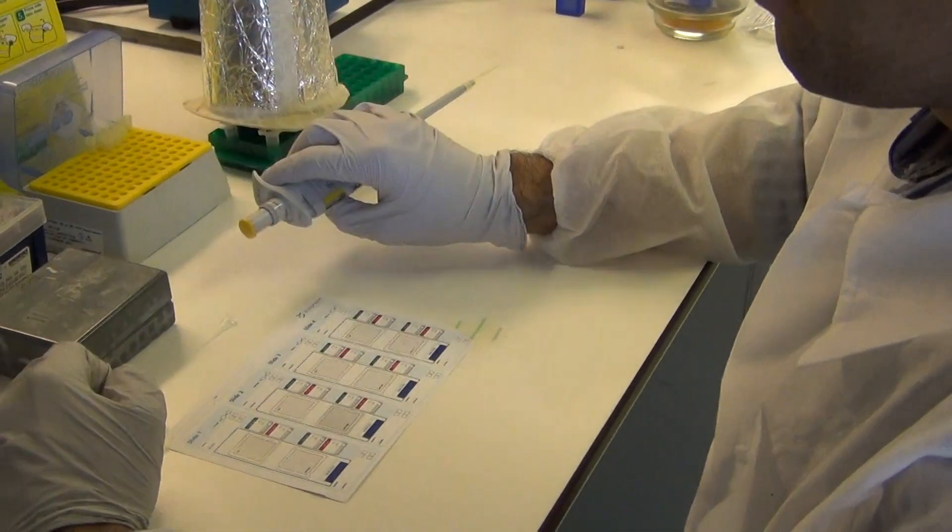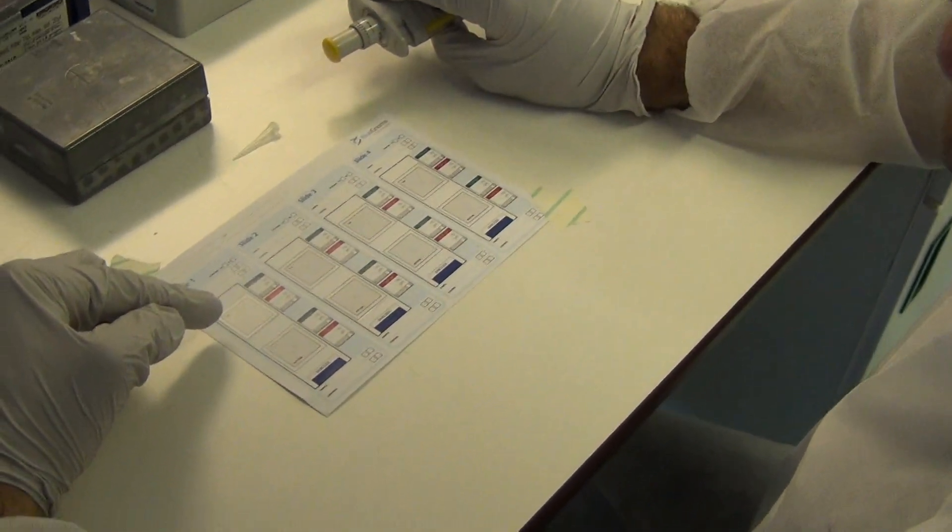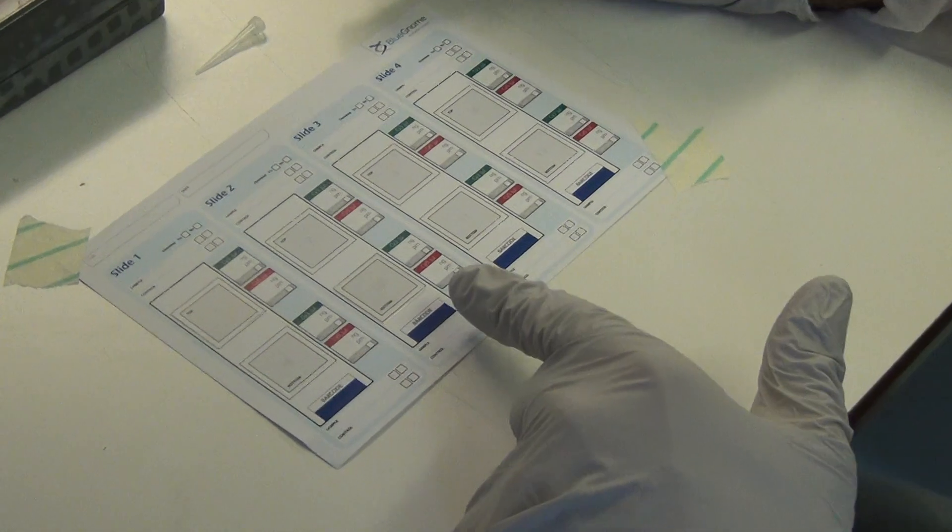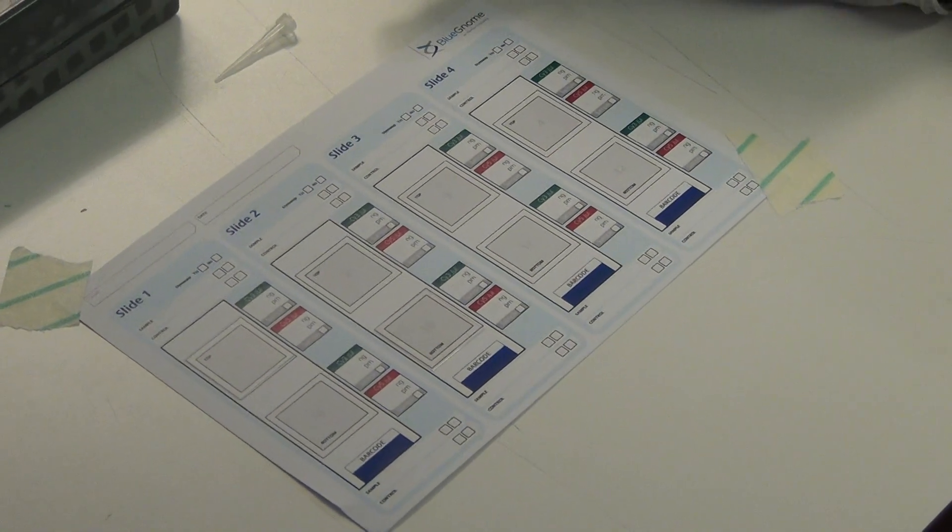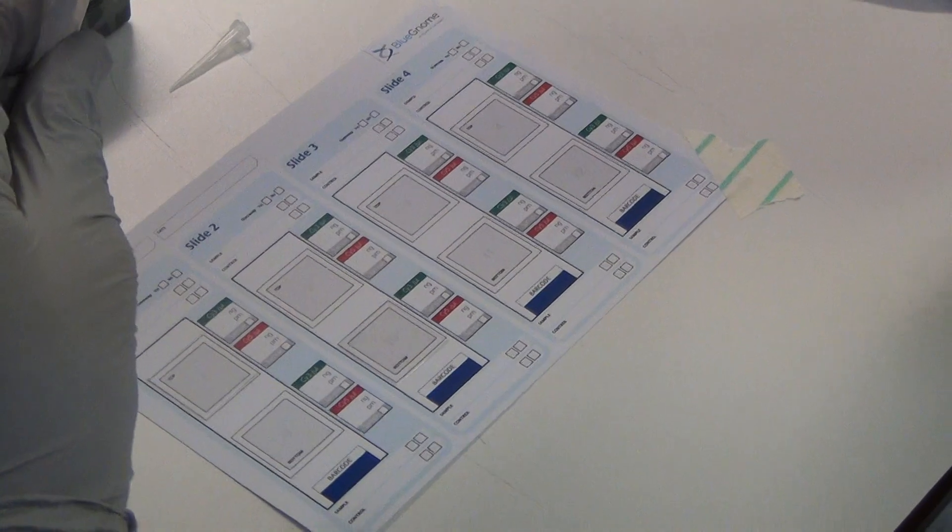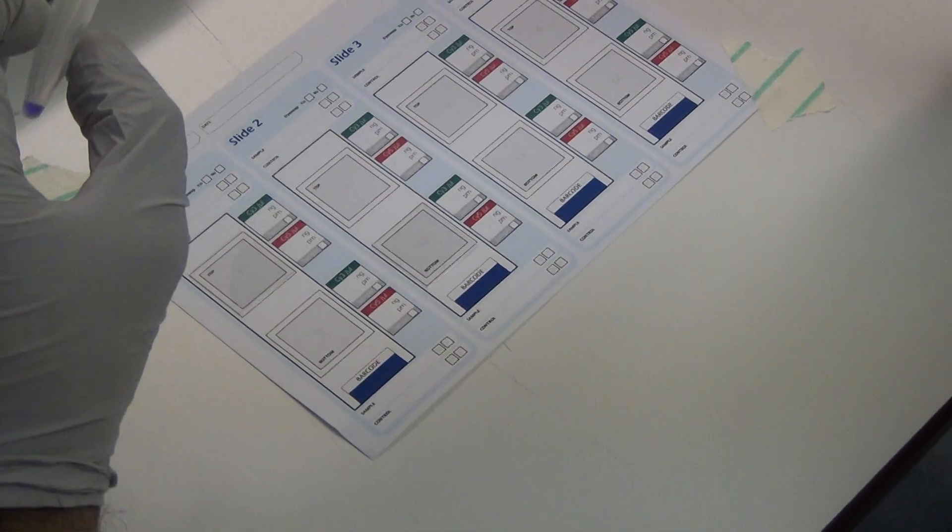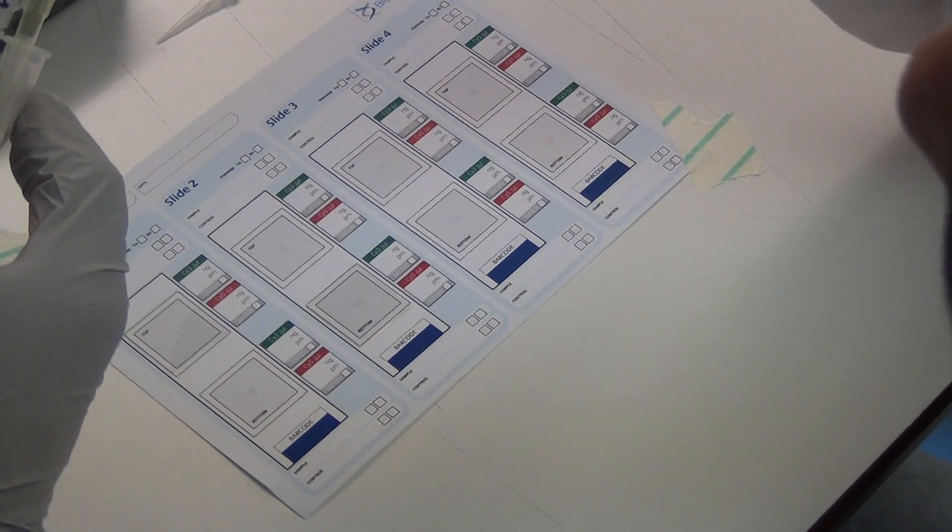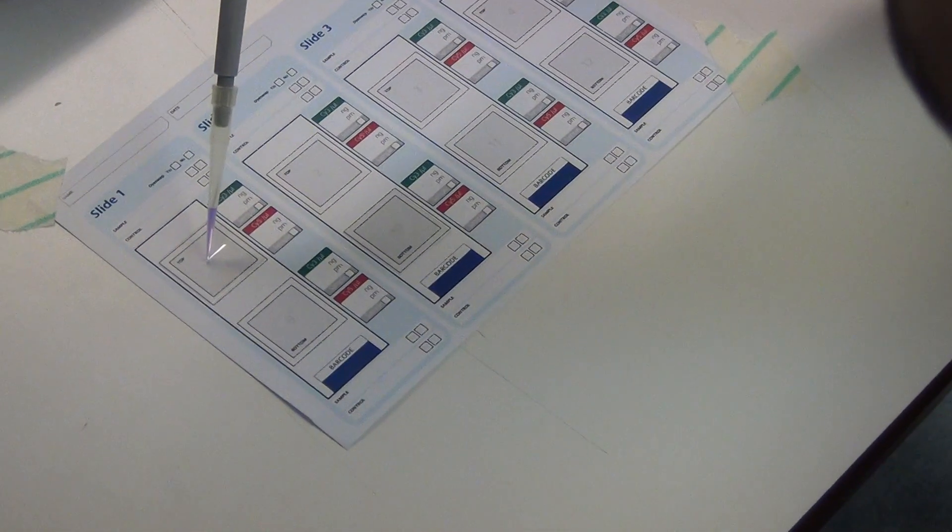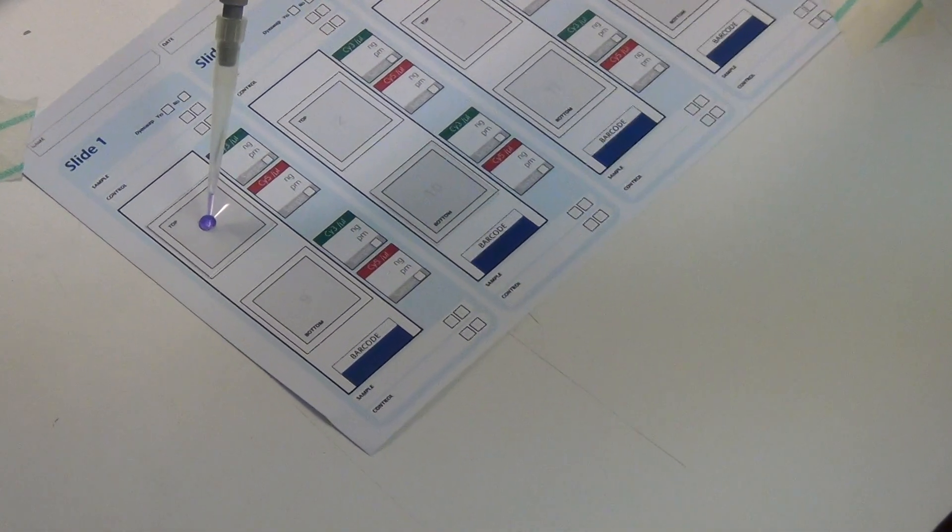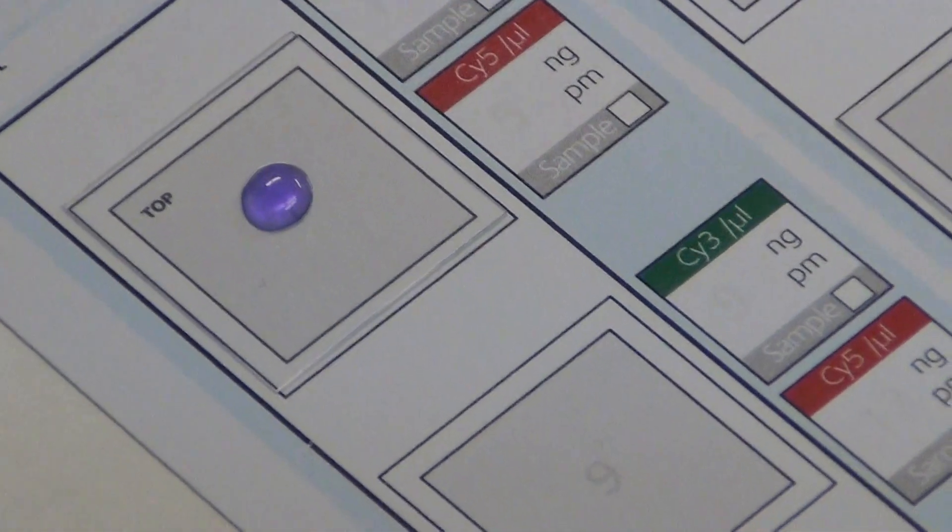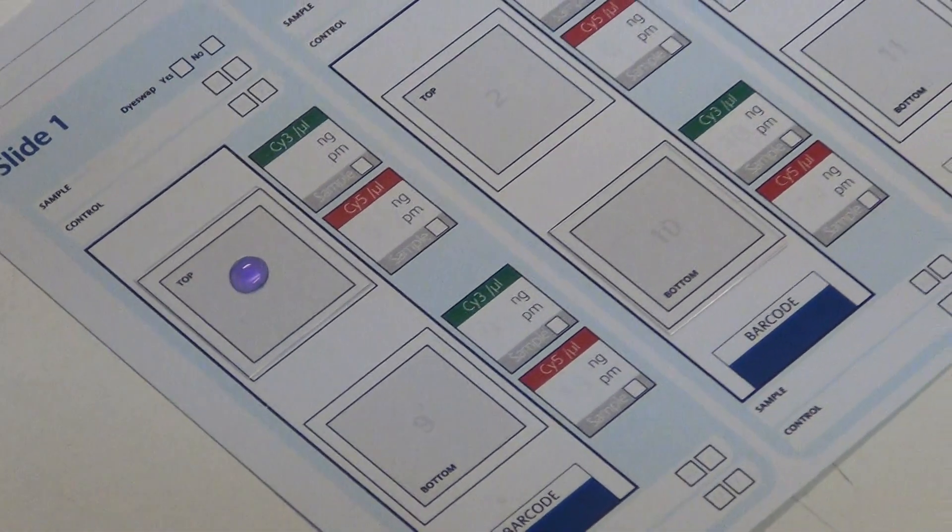First, place two coverslips on the designated top and bottom positions of the illustrated guide provided with the arrays. Second, dispense the products, taking care to avoid any air bubble formation. And now, to the bottom position.